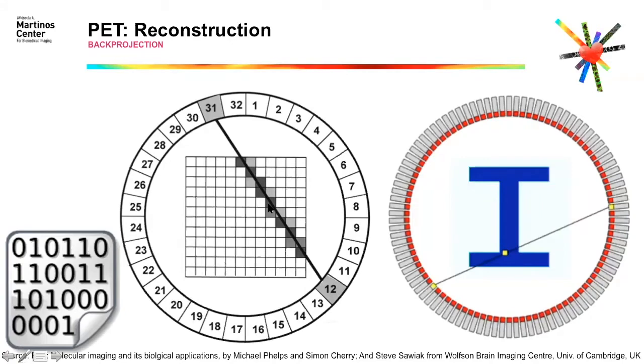The ones that cross a lot, like this one, cross from one side to the other, so it's almost basically the whole voxel, and it will be colored darker, and so on. So I will have a gray scale of colors, basically, through that line of response, yes? And again, I am going to do that millions of times with every one of those lines of response. And at the end, that is going to give me a slightly better version of the image, but still not perfect.